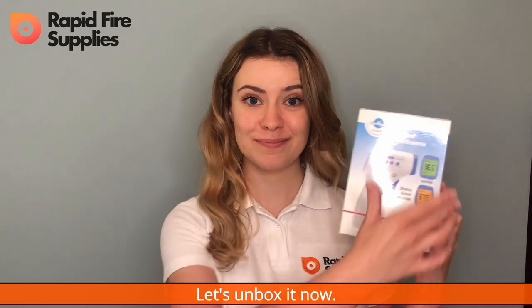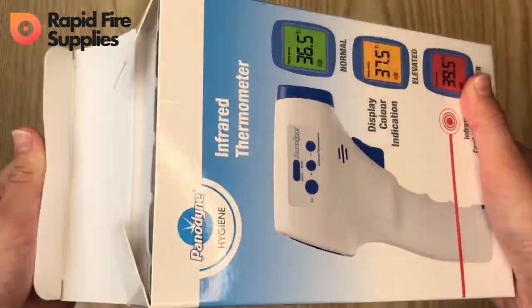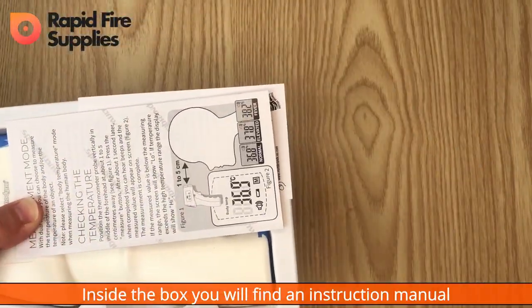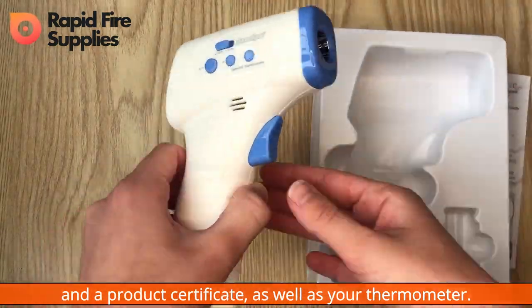Let's unbox it now. Inside the box, you will find an instruction manual and a product certificate, as well as your thermometer.